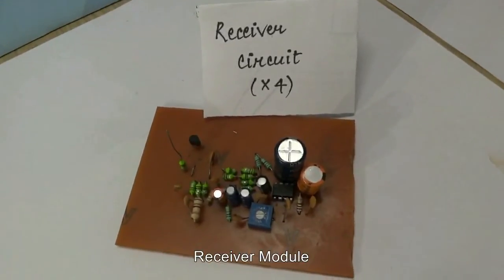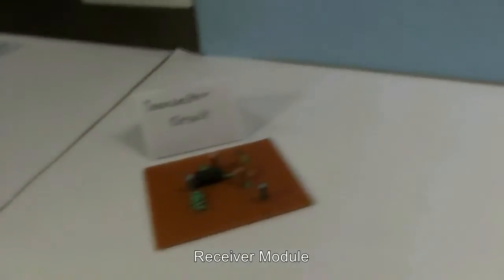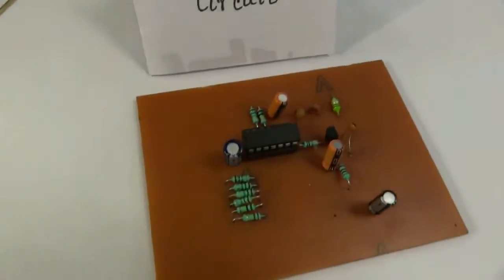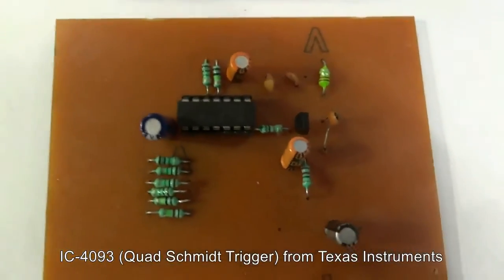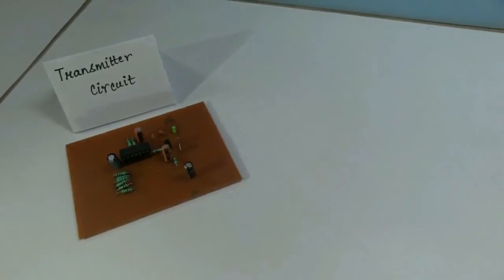The transmitter comprises the IC 4093, which is a quad 2-input Schmitt trigger NAND gate provided by Texas Instruments. It is used to clean up noisy input signals by passing on a tidy sequence of zeros and ones.